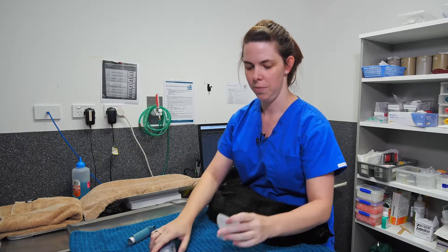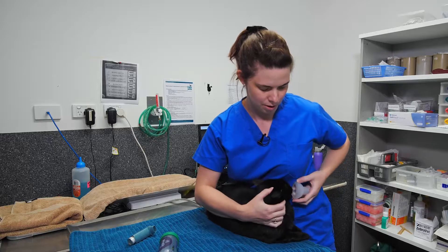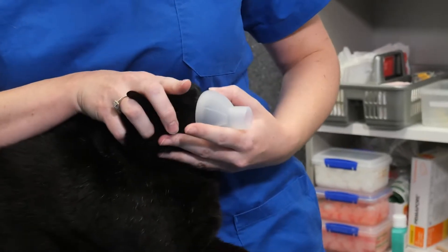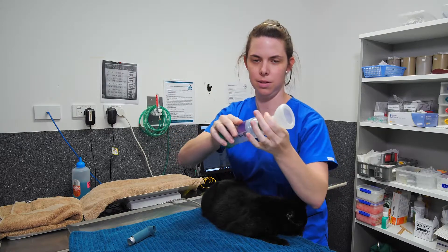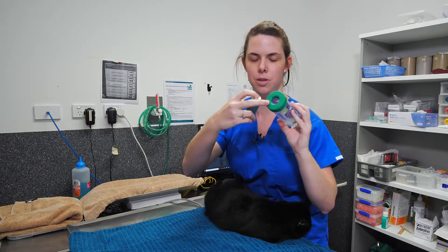With the two different sizes, you want to choose the one that will go comfortably around their face without covering their eyes — that's a good fit for Midnight. Next, put the two pieces together; they just squeeze on. Then add your inhaler to the back.